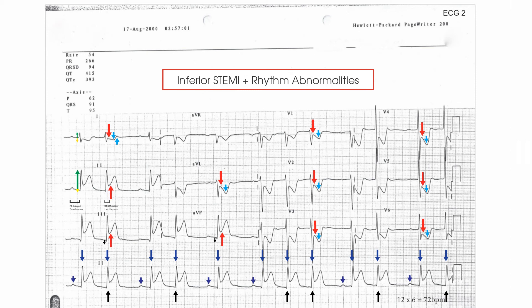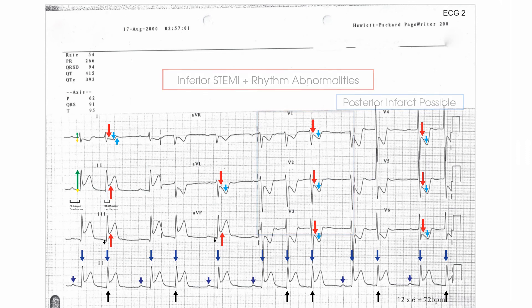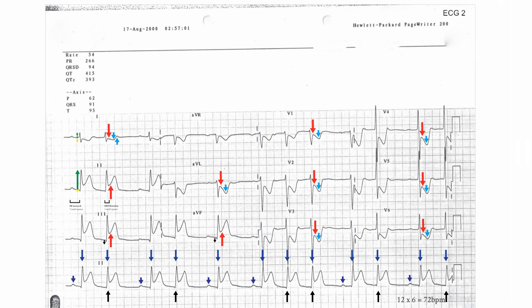It's possible that the T-wave inversion and ST-segment depression in the anterior leads represents posterior extension of the infarct. Posteriorly placed ECG leads would help to confirm this, i.e. V7 and V8. The rhythm abnormality, whatever it is, probably represents ischemia of the sinus node.